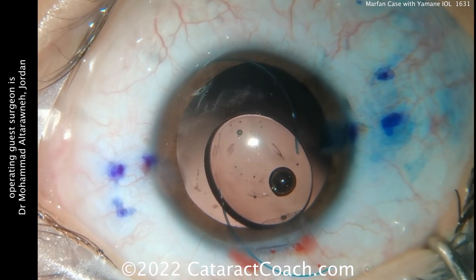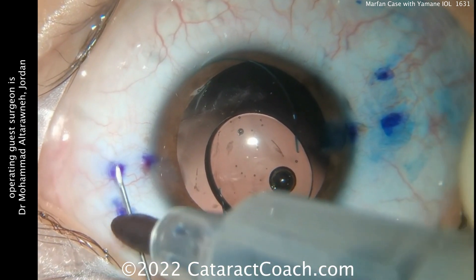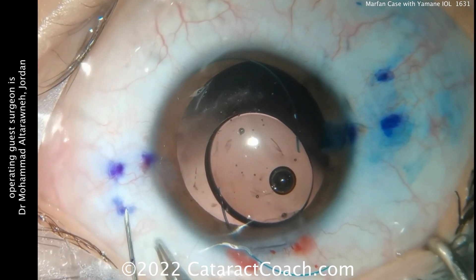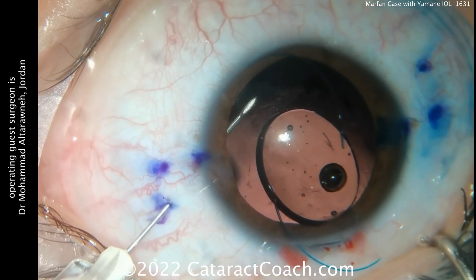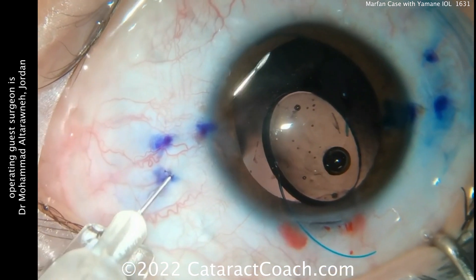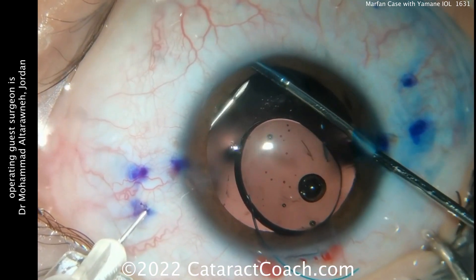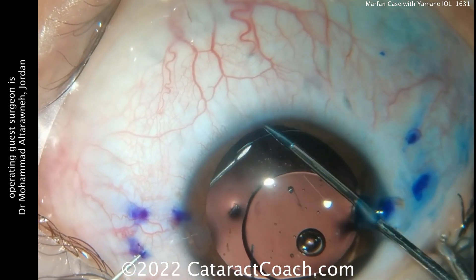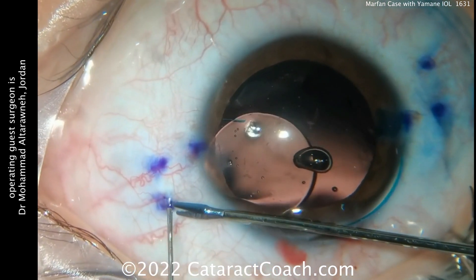There's a 30-gauge needle — these are the TSK thin-walled needles. They're going to be passed between those two outside marks. Notice the mark on the needle to give a good estimate of how far to pass it — I like that technique. Advancing it and entering the eye, you can use micro forceps to feed that first haptic into the bore of the 30-gauge needle. Feed it in a little bit more than you think; it makes it easier so it doesn't slip out as you pull the needle through. And as you pull the needle through, there's that haptic. Really pull that haptic out fully.